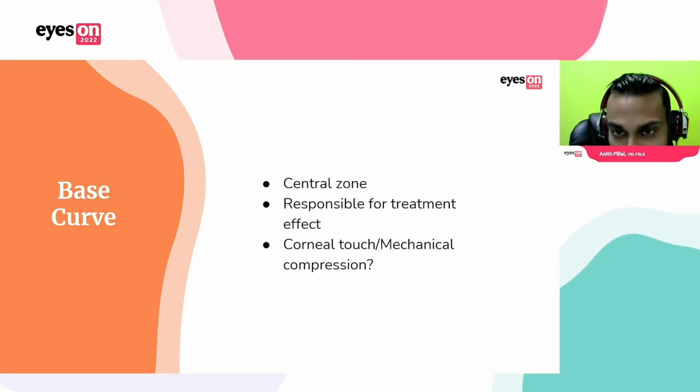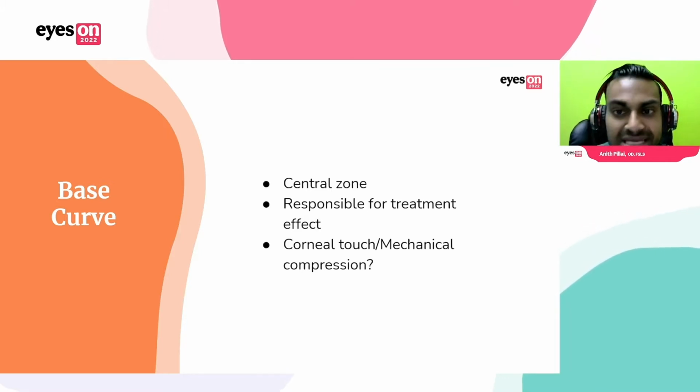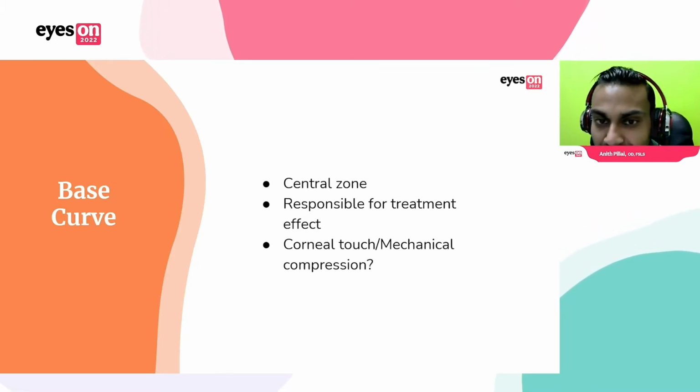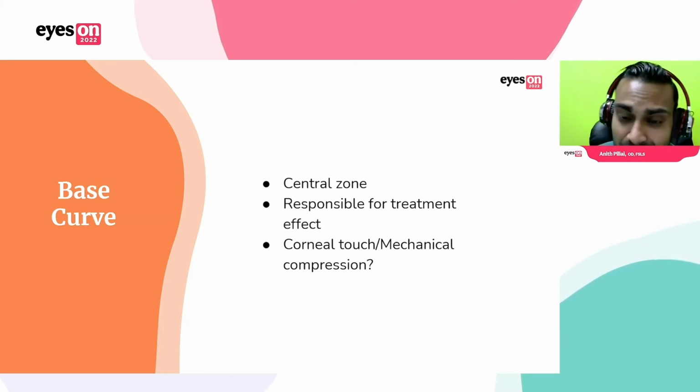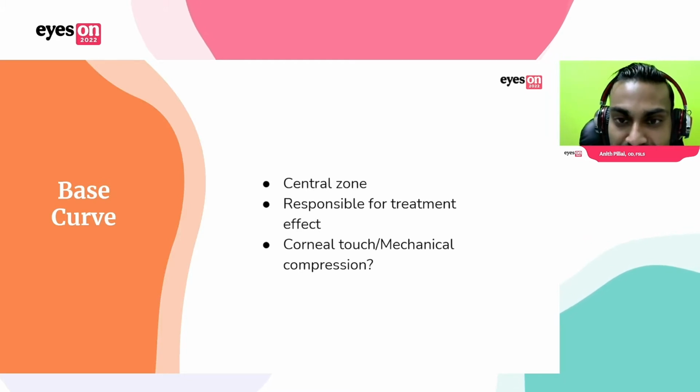How much refractive error are we correcting? How much myopia are we correcting, or hyperopia or astigmatism? This is the area for correction. And how are we achieving that correction? As I said before, it's not mechanical. We don't want any central applanation or epithelial disruption.